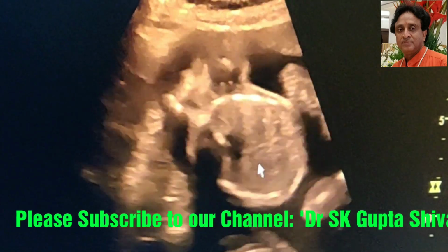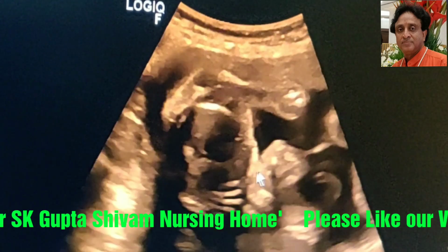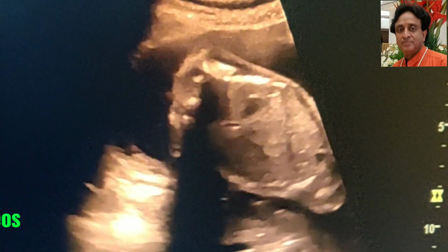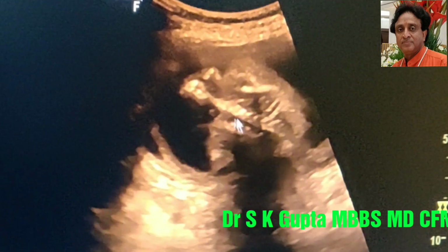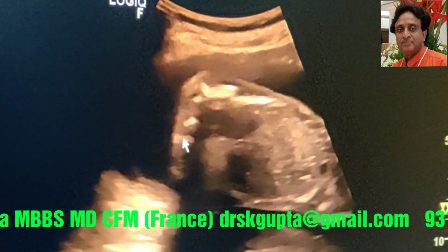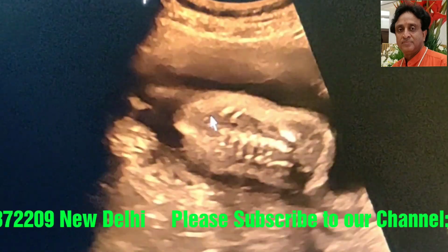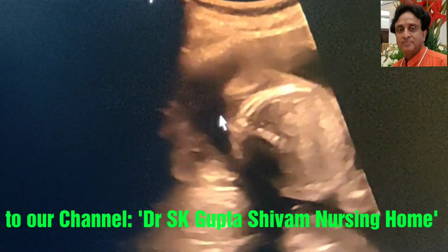The twin 2, and you can see that the heart is nearly normal. The heart is 4-chambered in twin 2, which is the anencephalic twin. You can see that the upper lip is also normal. This is the spine of twin 2, the anencephalic twin, and you see that the spine down below is normal, but there is a spina bifida defect in the cervical region of the fetus, and it is expected because there is acrania, and the cervical region is likely to have an open neural tube defect.